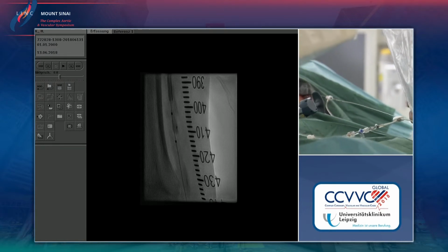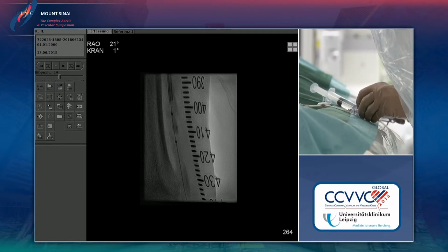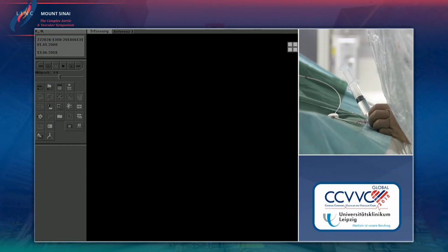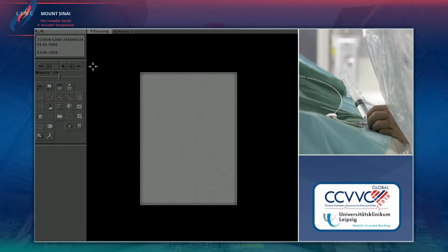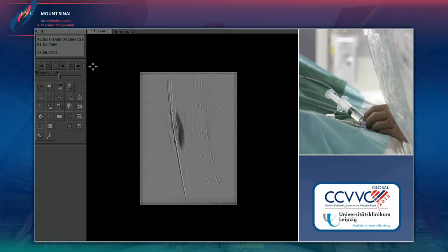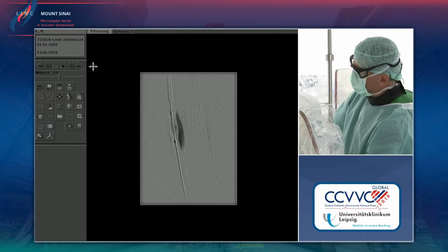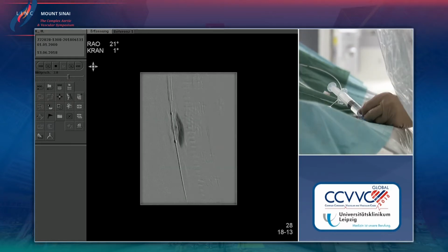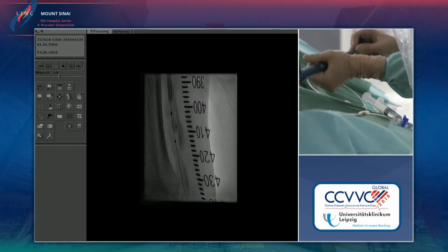But I expect, in fact, some injections not to go into the surrounding perivascular tissue because of the calcium here. That's also nice. So now it looks as if it would only go to one side, but over time we will see it spread also to the other side.